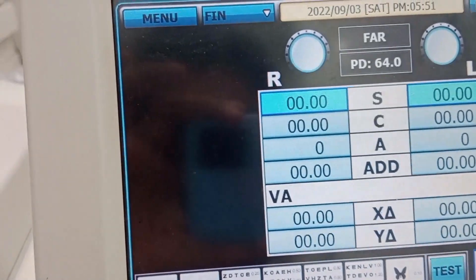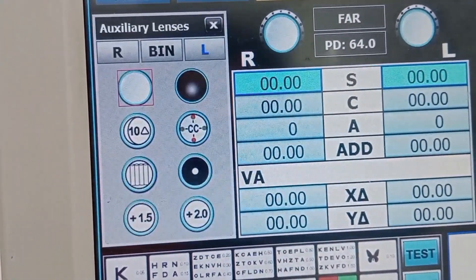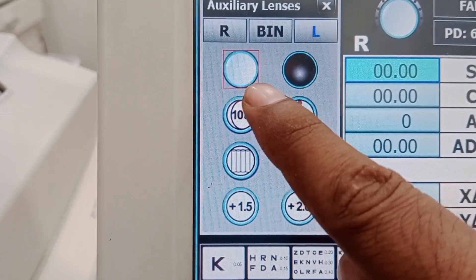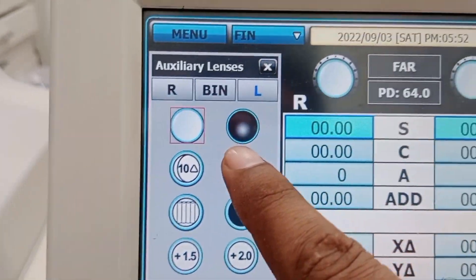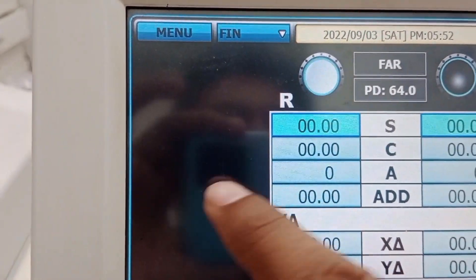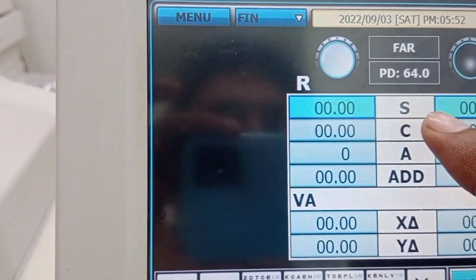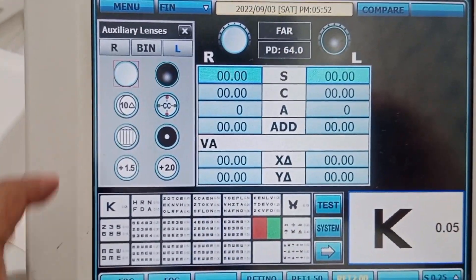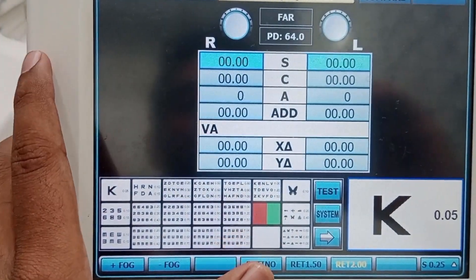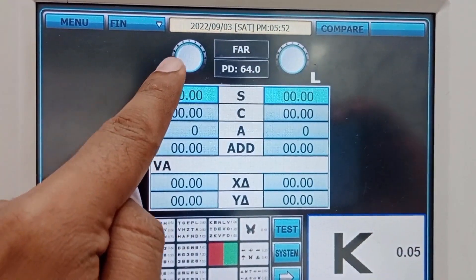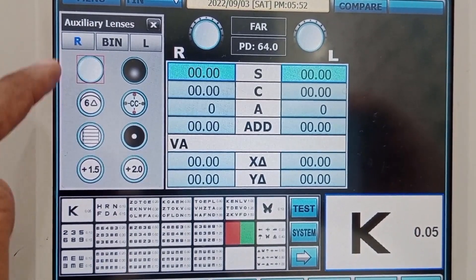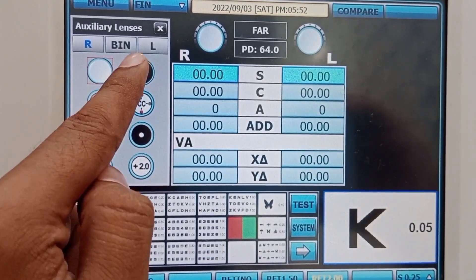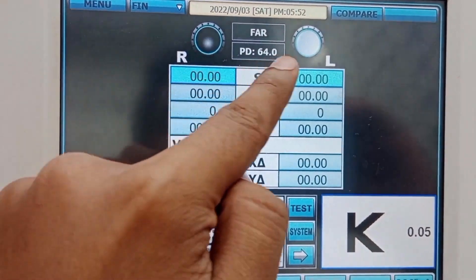You can see there is a plano lens and an occluder. If I press the occluder, the left eye is occluded. I can open both eyes so right and left are both open. If I click on the right eye and press the occluder, the right eye is occluded and the left eye is open.